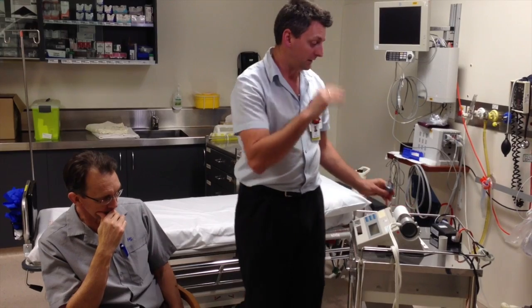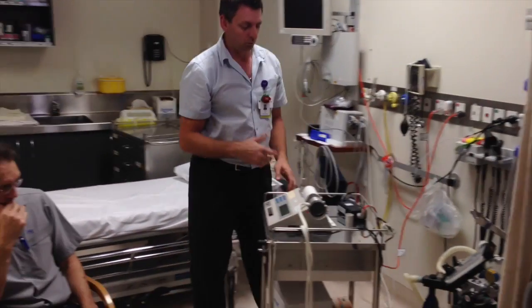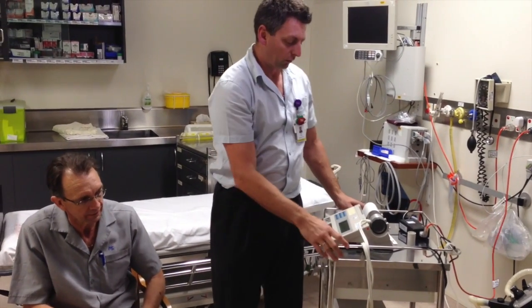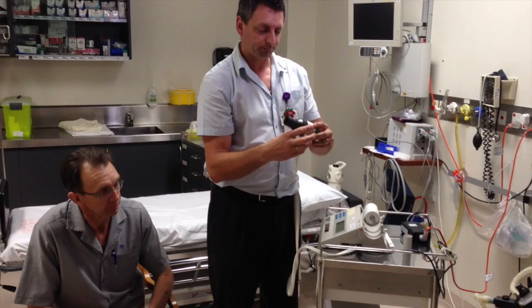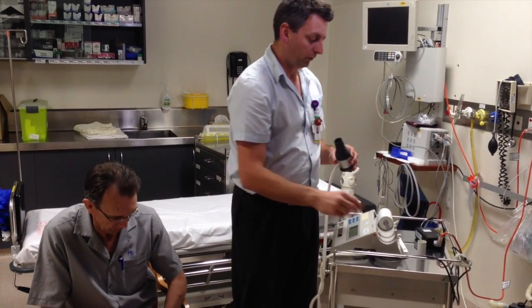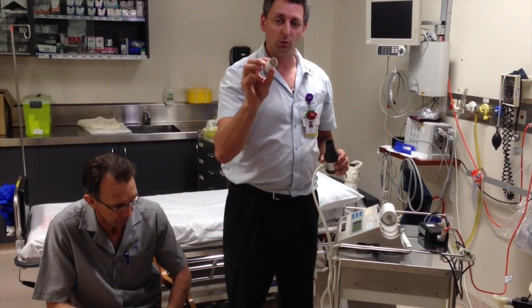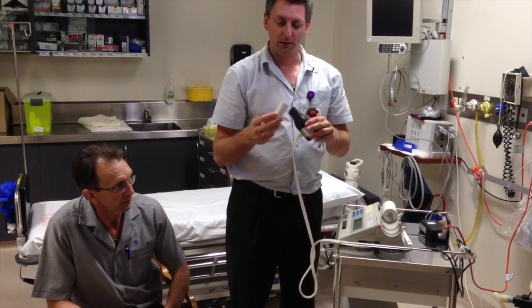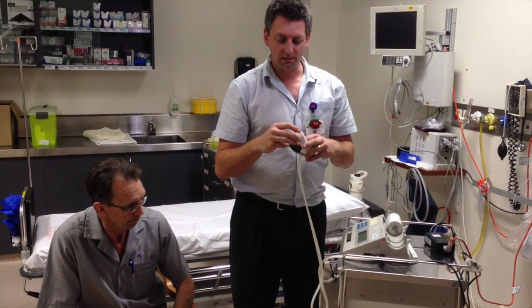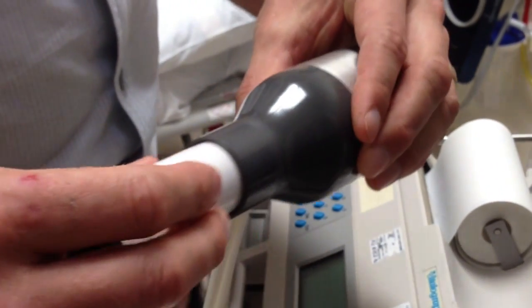It doesn't have a battery supply so it needs to be plugged in all the time. So I've just plugged that in. When it's sitting on the side you don't have to worry about it. It has a mouthpiece here — that's where the person will breathe through. We have a little disposable mouthpiece for the patient. There's a plastic end and a paper end; the paper end goes into the end of the mouthpiece.